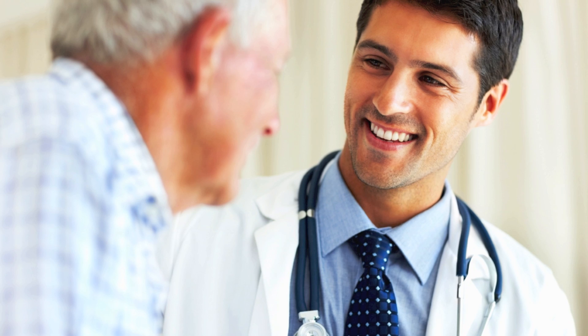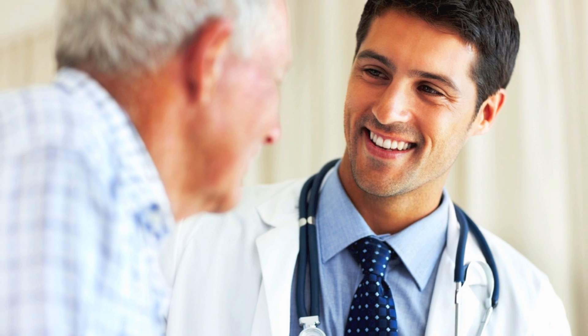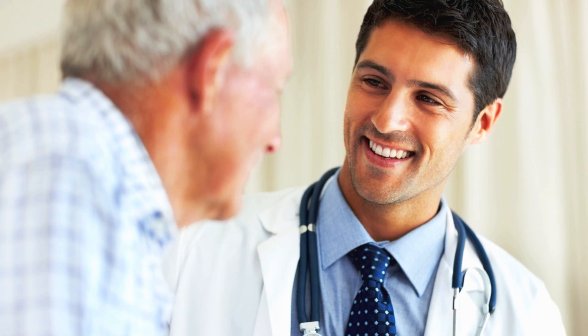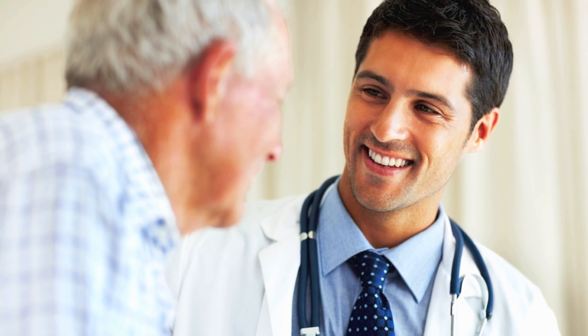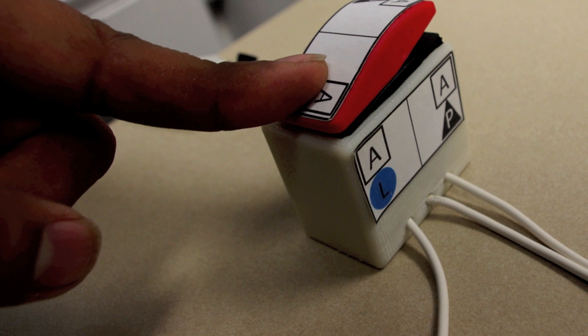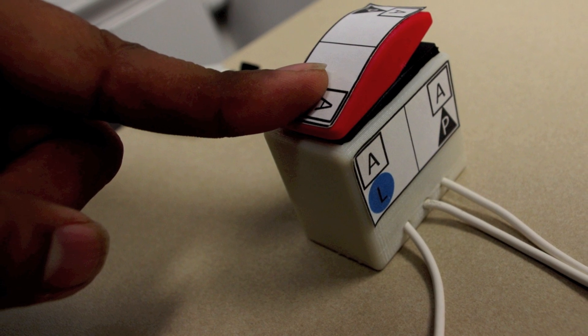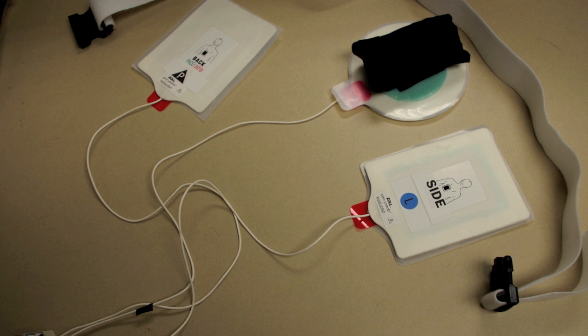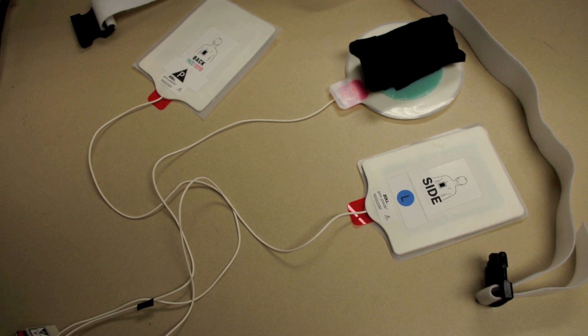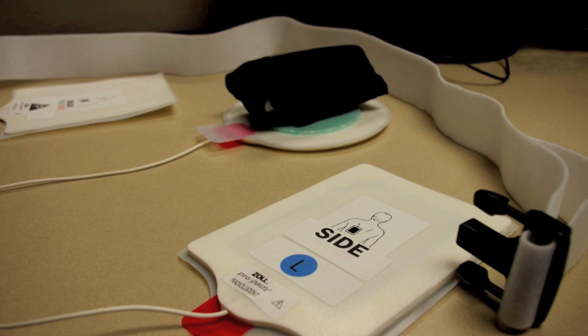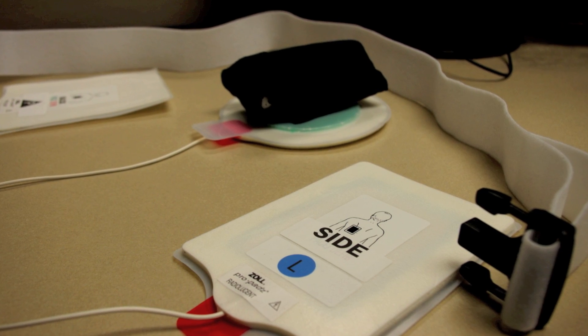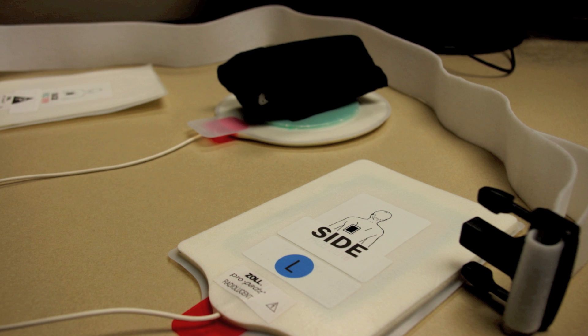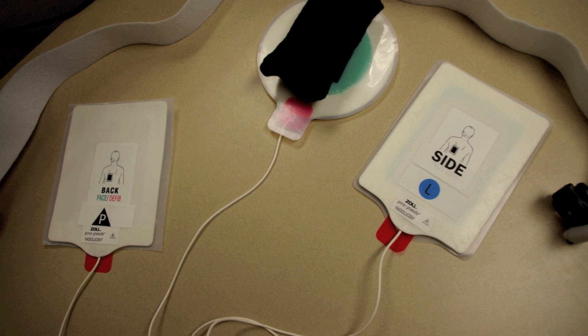The Presto Patch is a very simple, intuitive design for doctors to use, designed to help them make life-saving decisions. Presto will make it easier, quicker, and safer to keep patients' hearts always beating in healthy sinus rhythm.